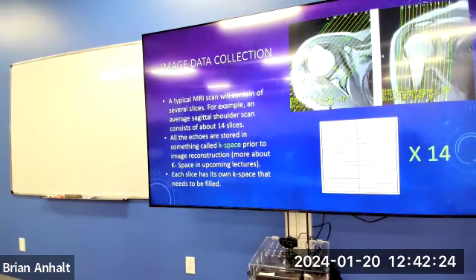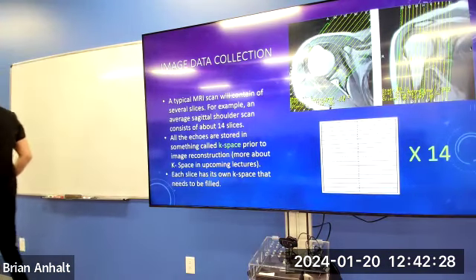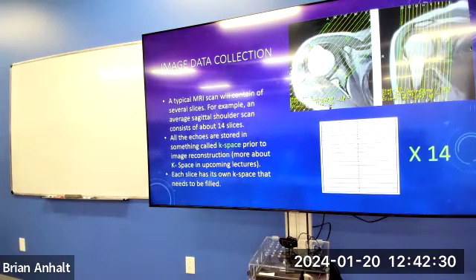Brian, just to clarify, the thicker the slice, the more proton density it will have, then better signal. No, well, yes, the more protons. But don't confuse that with proton density contrast. There will be more protons in a thicker slice and better signal. You're 100% accurate. It doesn't change the contrast though. The only things that are going to change the contrast are the TR, TE, and flip angle. We'll find out.